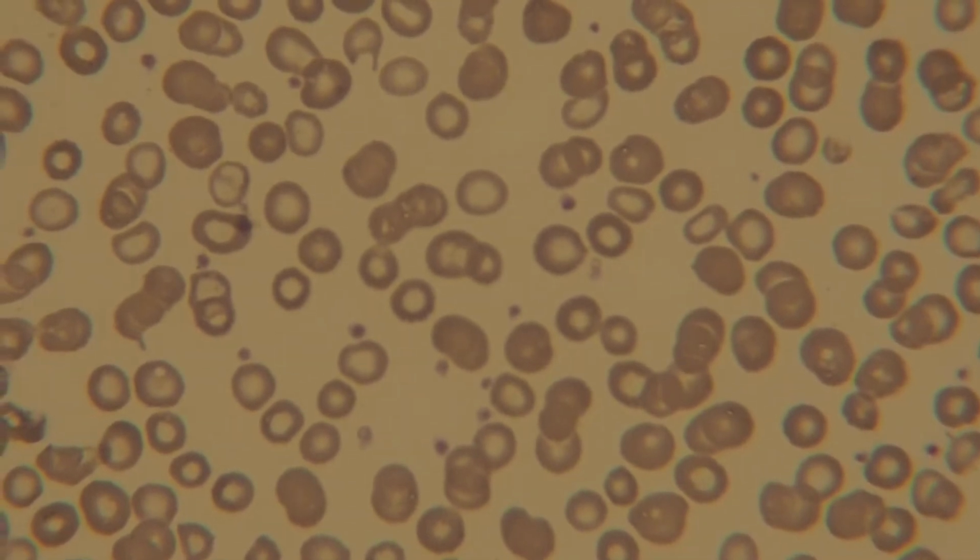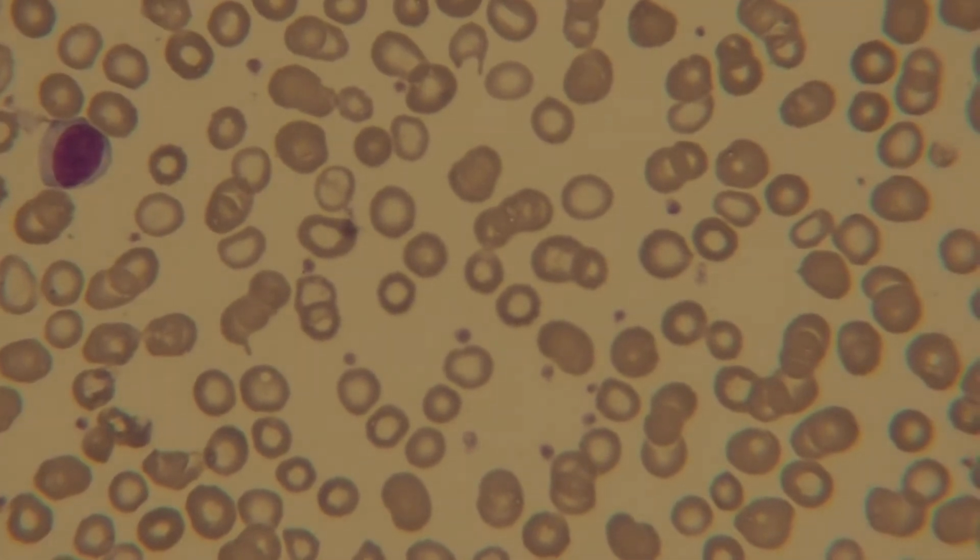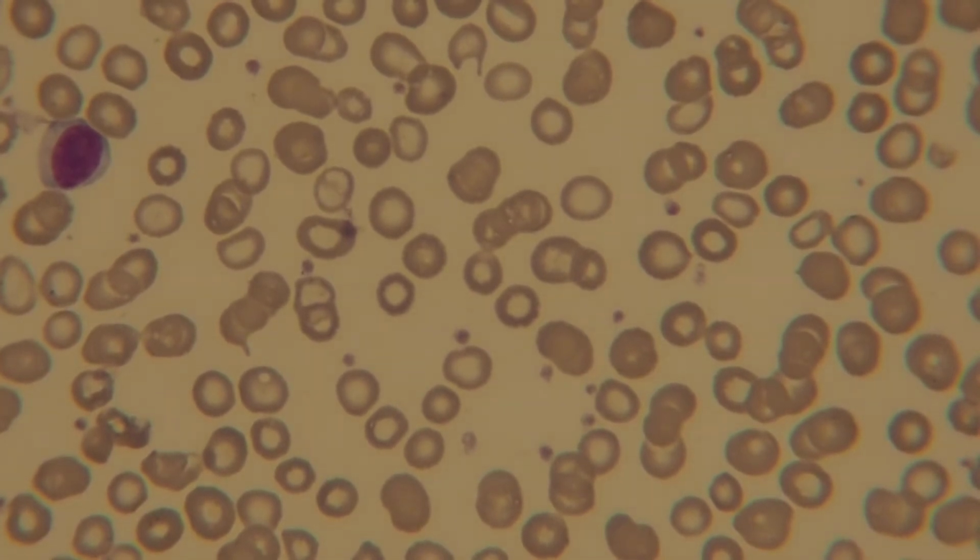Not only that, but here you can see, let's find a lymphocyte. It's not the most mature lymphocyte, but you can have an idea. There is definitely some hypochromia, a marked anisocytosis. I think I would even give it a 3+ anisocytosis. And sometimes when you have rouleau like this, the instrument tells you you have a macrocytosis.